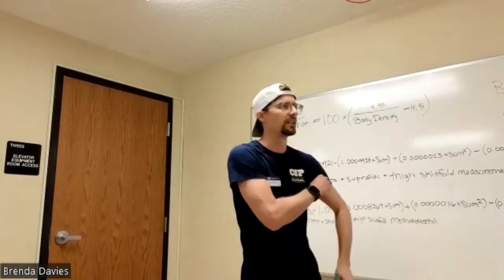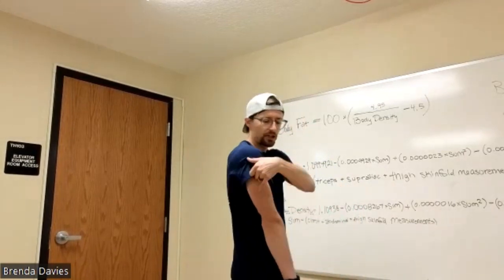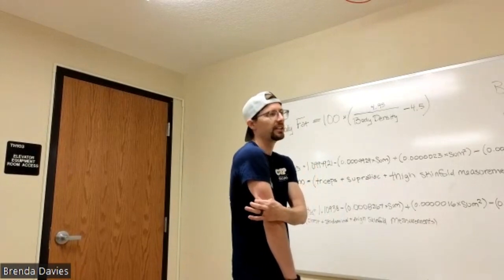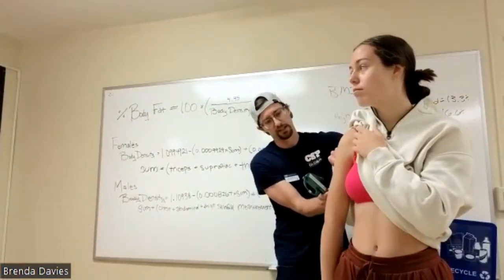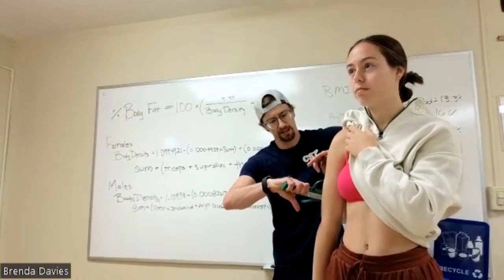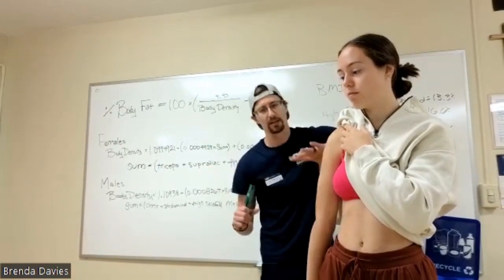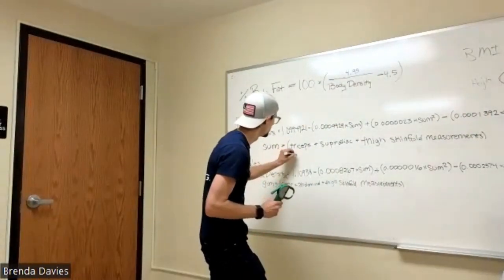So are you wearing a t-shirt? Okay, so yeah, I'll just do the tricep for you. So tricep location is going to be halfway between elbow and the shoulder, and it's going to be in the mid belly of the tricep. So let's take that measure here. So I typically do both hands, and then go ahead and flex. Okay, having the person flex is going to separate that muscle from the subcutaneous fat, and then we're going to measure this below the pinch, so I'm not compressing that subcutaneous fat too much. I'm going to release the caliper and release the pinch, and then I'm going to write down the number for the triceps, which was 14.